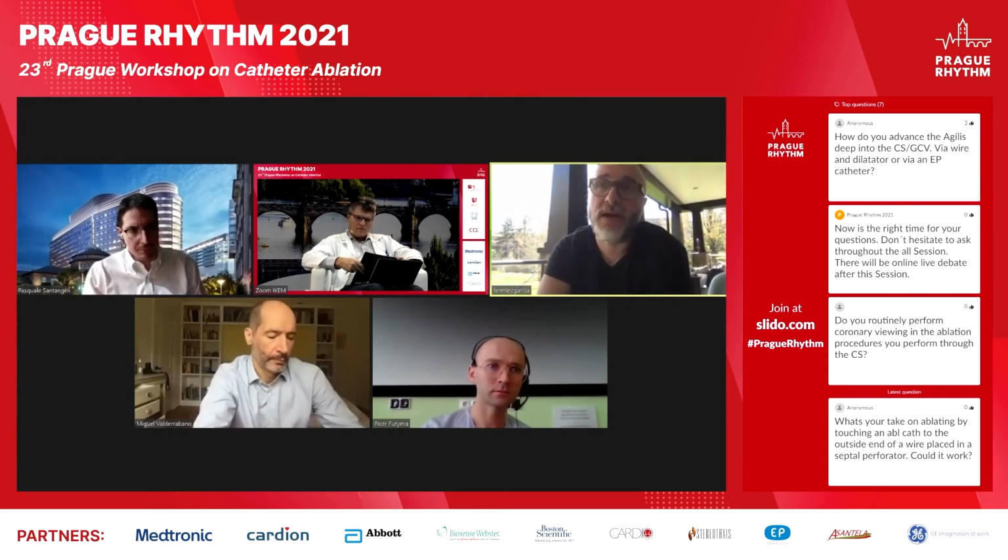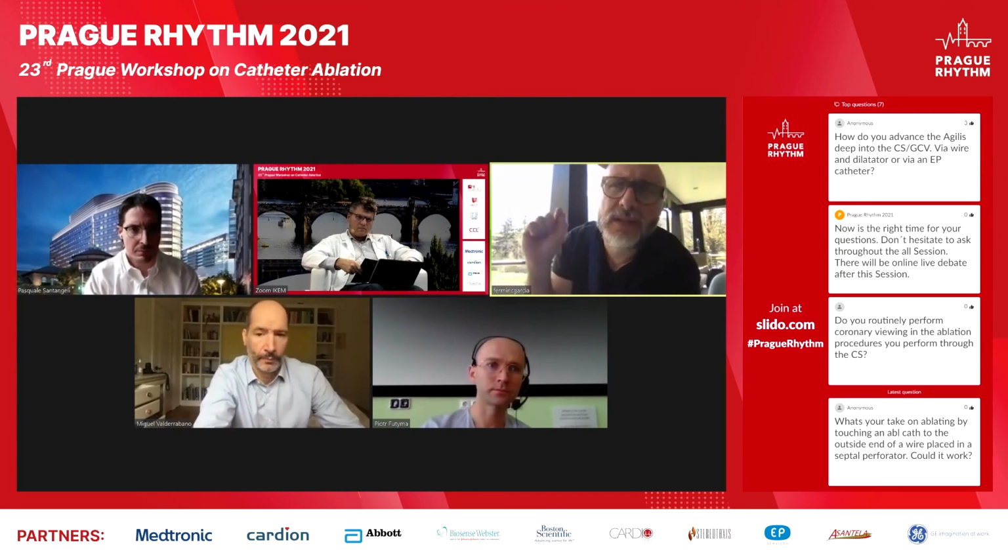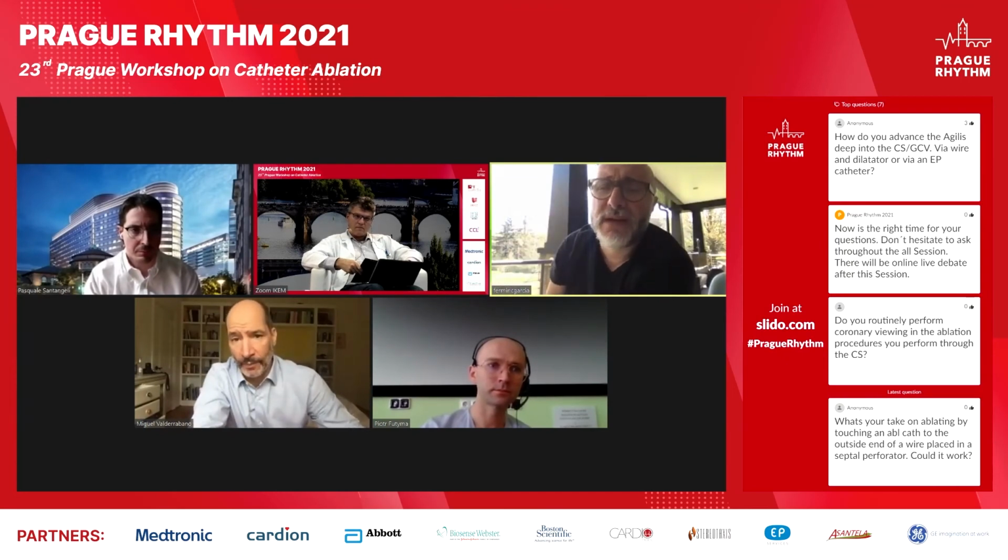You can use a cheaper LAM 90 or whatever sheath you have in yours. But Agilis, just with the wire, no dilator, no ablation catheter, it just goes right in. So Miguel, one question. Are you doing this as your first strategy for everybody?